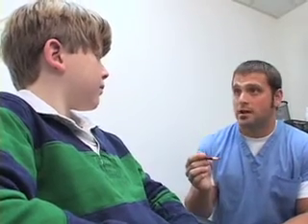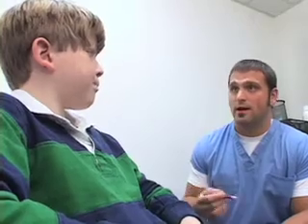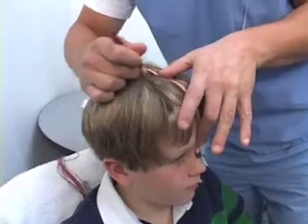I have to measure your head with this tape measure. During the setup, our caring and highly skilled technologist will educate you on the process and answer your questions about this safe and painless procedure. First, the head is measured and marked to ensure proper electrode placement.